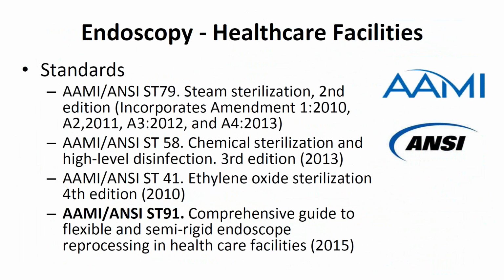When it comes to endoscopy, what are the standards that you really should be familiar with that surveyors might be using? Of course, there's ST79, and within that there's cleaning and disinfection. Then there's ST58 and ST41. ST58 applies if you're using chemical sterilization or high-level disinfection. This is information you need to know. The surveyors know it. And if you're using ethylene oxide, that's standard ST41.